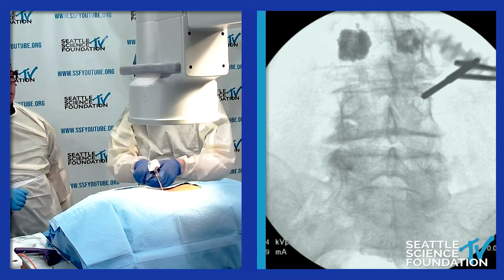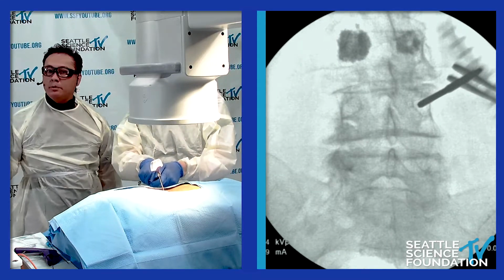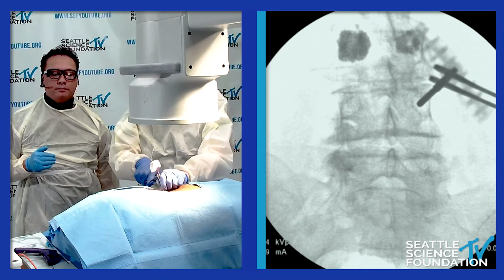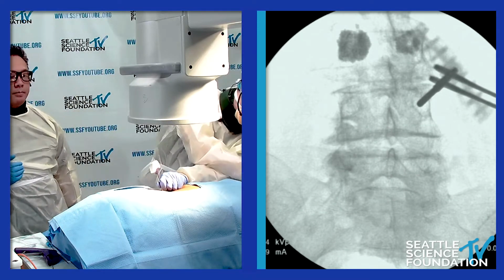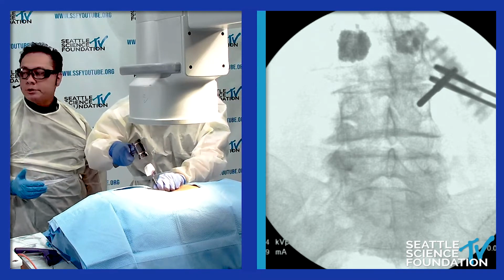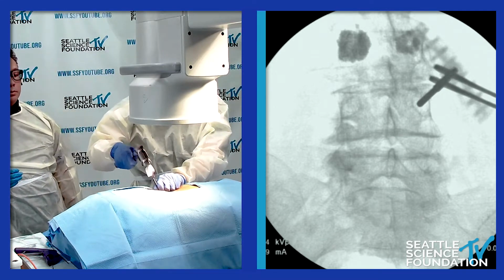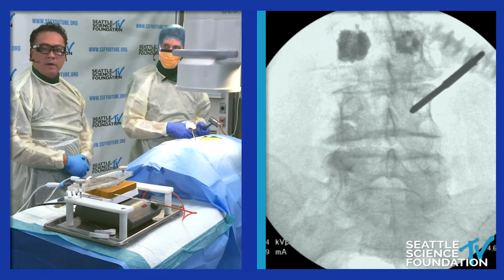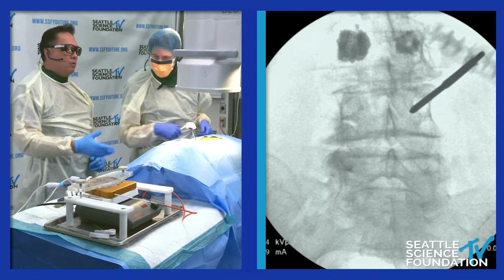With balloon kyphoplasty, you're creating a cavity. So with that, there's room for the cement to not only provide some height restoration, but also to help reduce kyphosis.